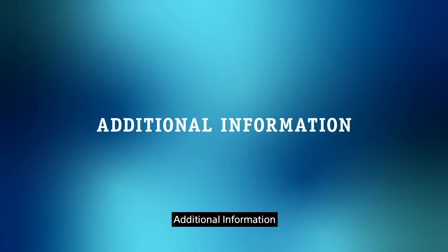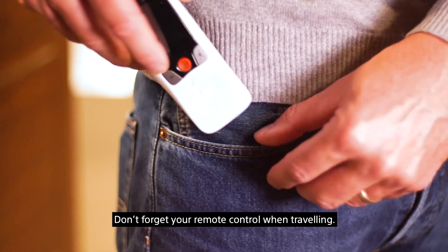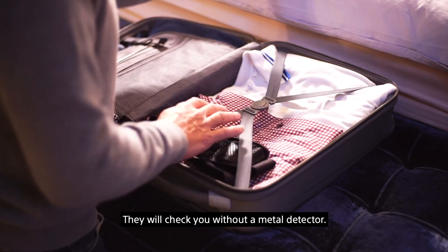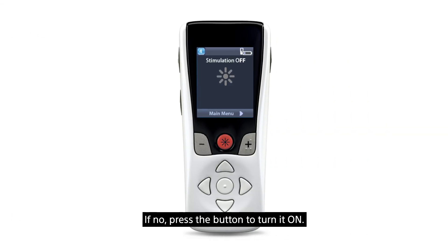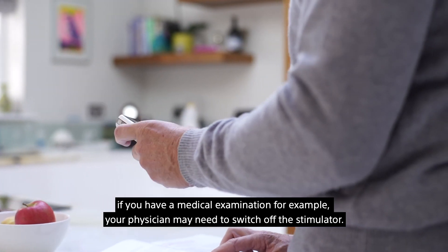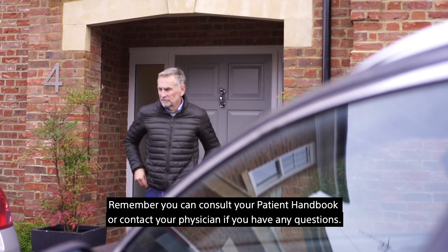Don't forget to always keep your patient ID card with you. Please show it to your physician if you have to pass any medical examination or an MRI scan. Don't forget your remote control when traveling. At the airport, avoid going through the metal detector gate — just show your patient ID card to security staff and they will check you without a metal detector. Try to avoid magnetic fields because they may temporarily turn off your stimulation. If you leave a magnetic field, check on your remote control if the stimulation is still on; if not, press the button to turn it on. Please keep your remote control with you, as your physician may need to switch off the stimulator during a medical examination. We hope this introduction to the remote control has been helpful. You can consult your patient handbook or contact your physician if you have any questions.